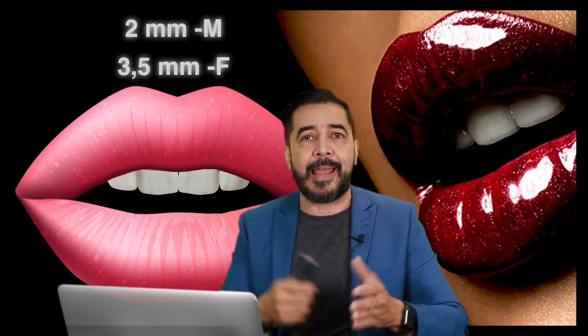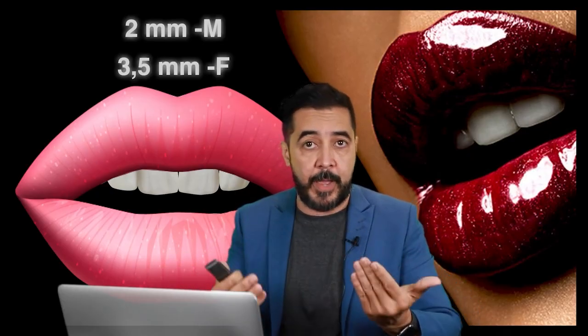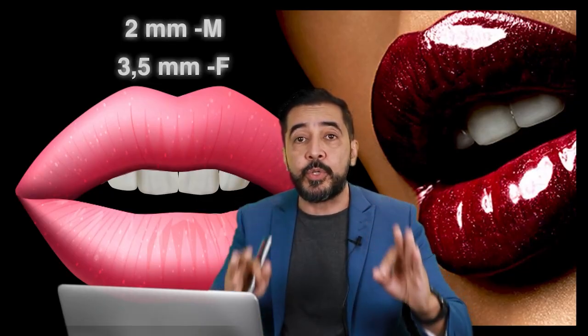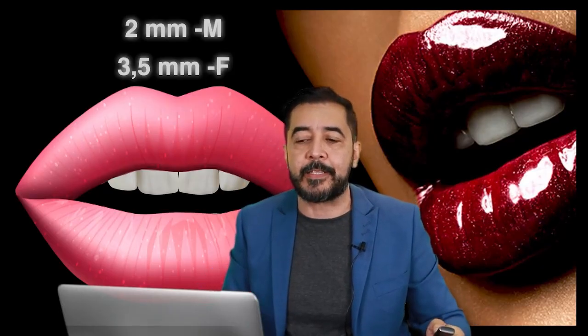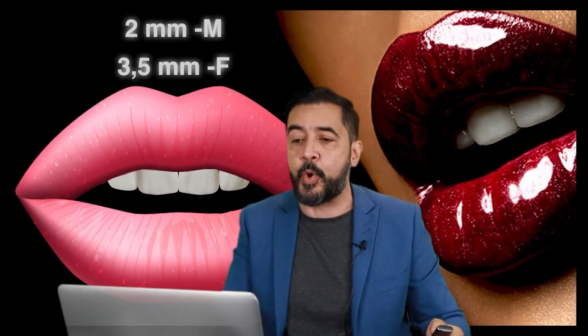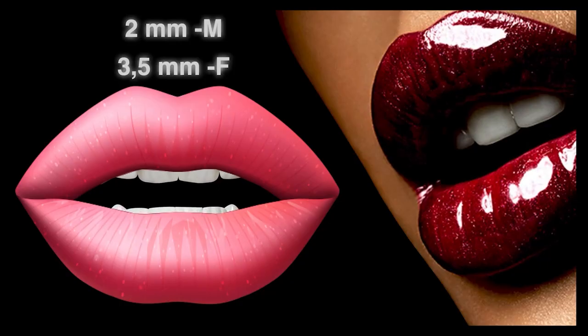So I let them, together with me, choose what's the best for them, okay? But we can do this in the beginning of the treatment, with the right positioning of the brackets during the initial phase of orthodontic treatment.